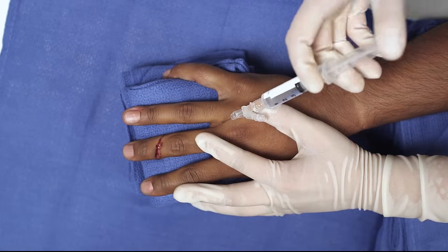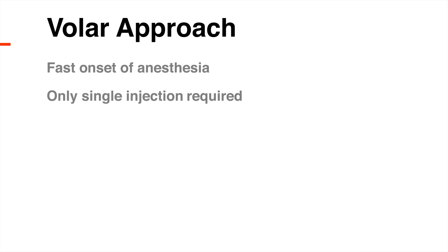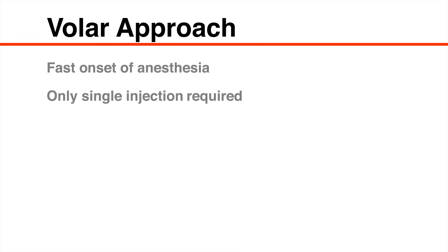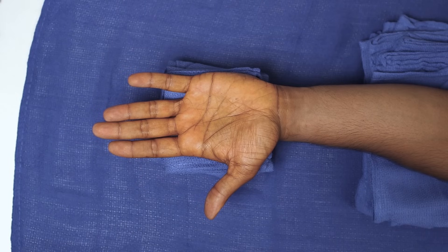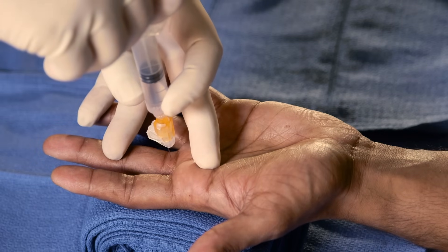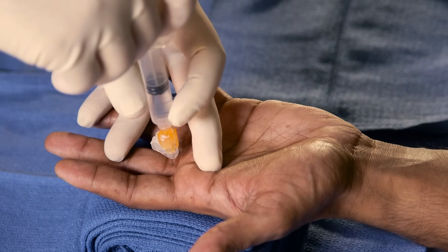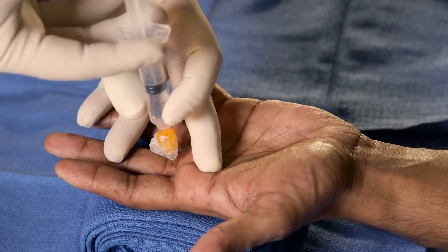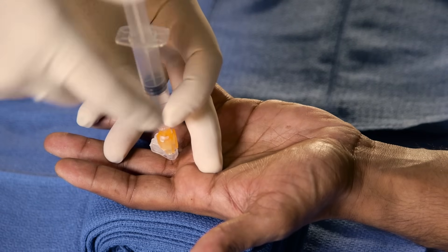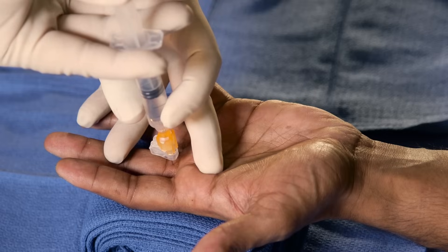Repeat the injection on the other side of the finger. Recently, the volar approach to digital nerve blockade has been discussed as an alternative to the traditional digital nerve block. Advantages of this technique include fast onset of reliable anesthesia with only a single injection. Examine the palmar surface of the hand and identify the crease where the digit meets the palm. Insert a 25- or 27-gauge safety needle into the midpoint of this crease. Aspirate, then inject 3 cc's of local anesthetic subcutaneously. In this process, the anesthetic is distributed to all four nerves from the one injection.